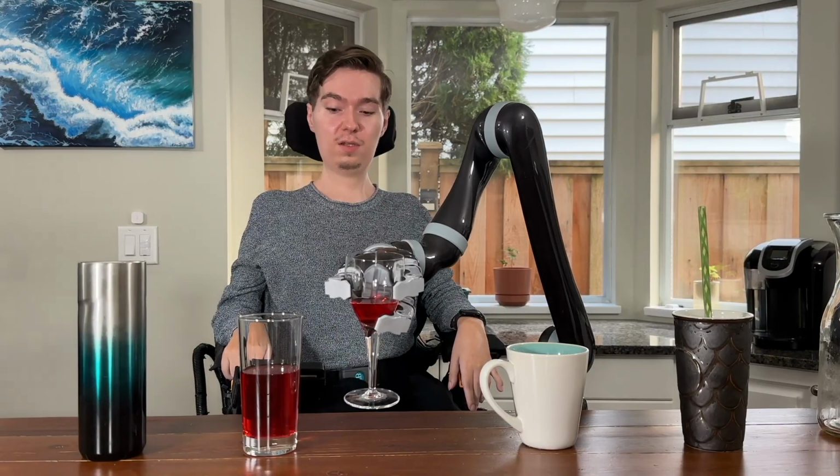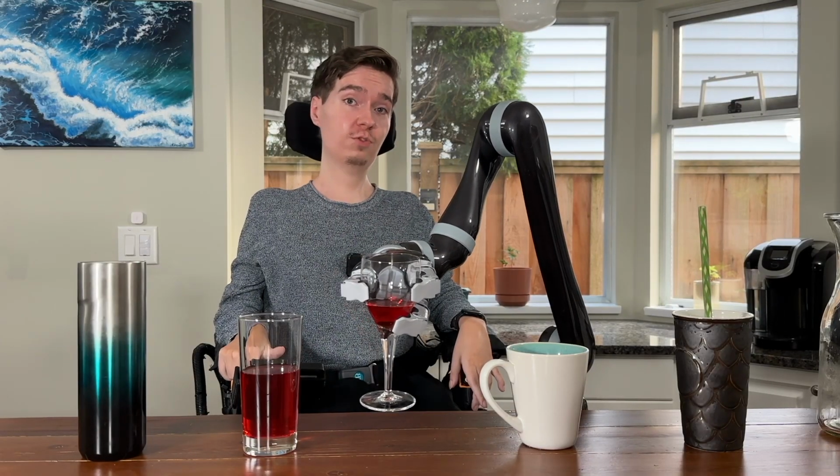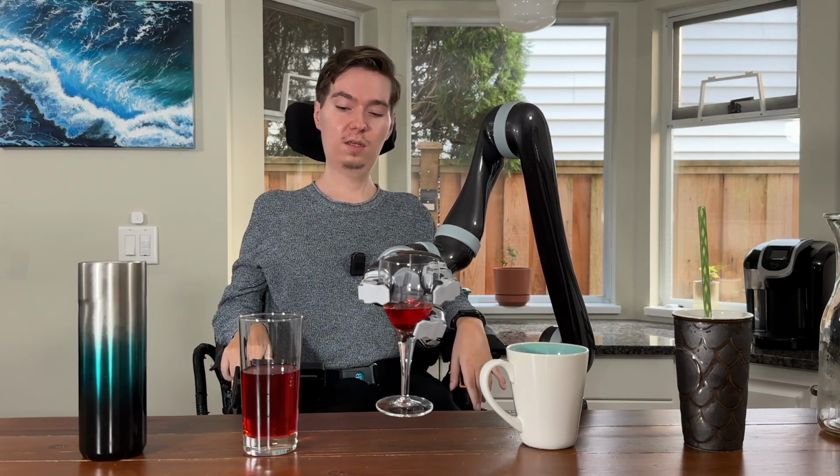So drinking mode is a great feature for those of you who prefer drinking without a straw. I prefer straws, they just make it a little bit simpler, but drinking mode is a great feature.